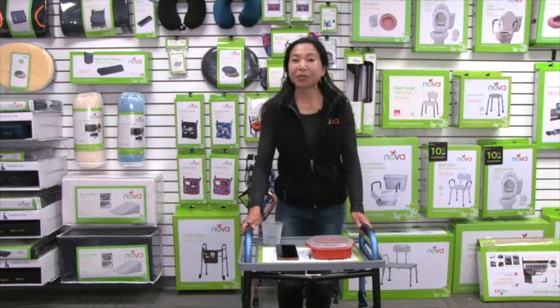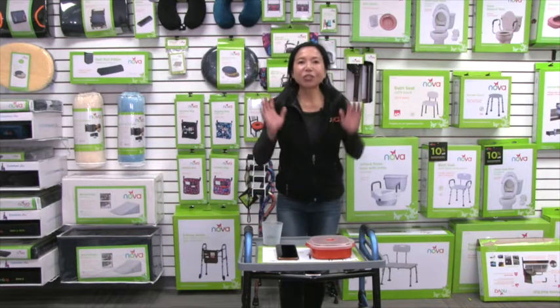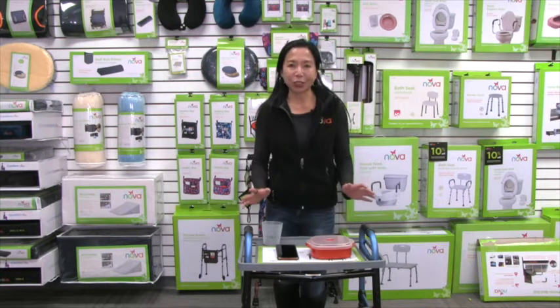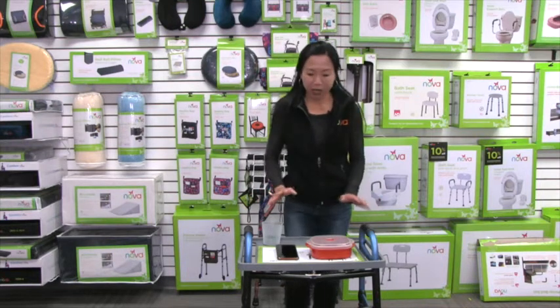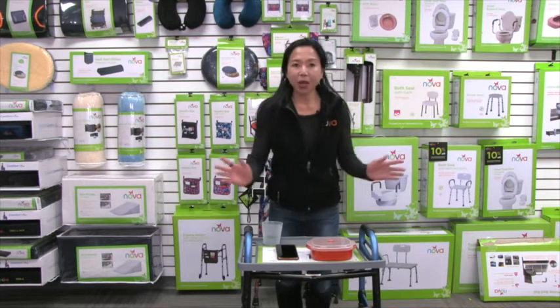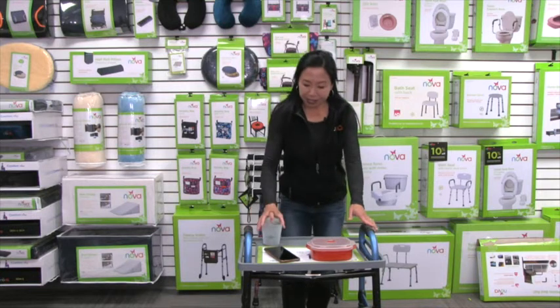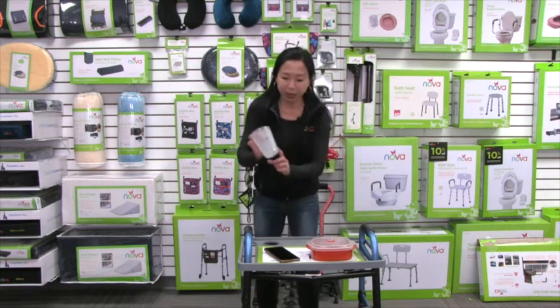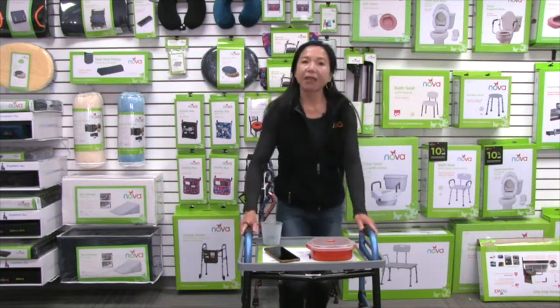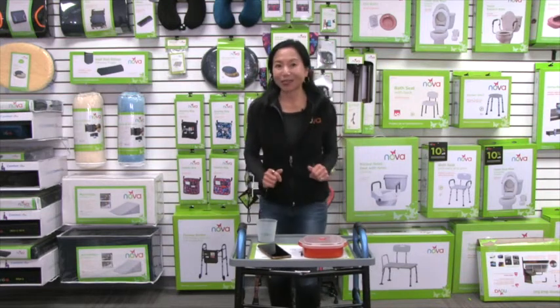This video is about the Nova food tray for folding walkers. This is a great add-on accessory for your folding walker. It serves as a food tray, so you can put food on there, but also great for personal belongings like a cell phone or keys. We've even got two cup holders to put drinks, so when you're walking with your walker, you can carry these things as well.